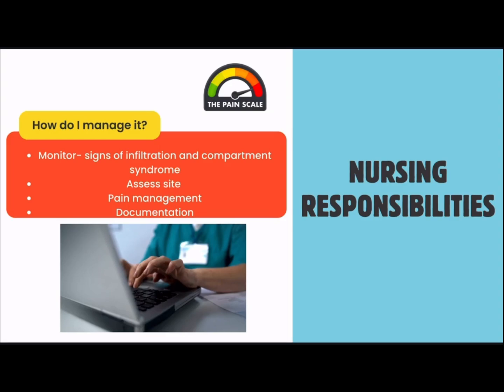And then we're going to look for signs of compartment syndrome. This might be observed with more prolonged use, which again is not optimal, or as a sign of a problem after you've had the IO in, or even removed. If there was any sort of trauma there, you might observe signs of compartment syndrome. So pain that won't go away with pain medication, swelling, really disproportionate pain is going to be one of those big things that we'll see.